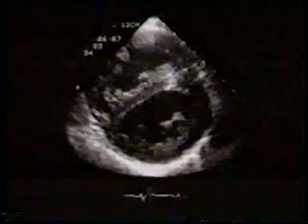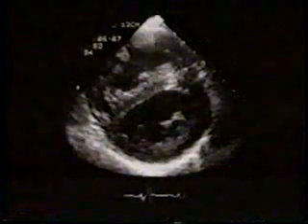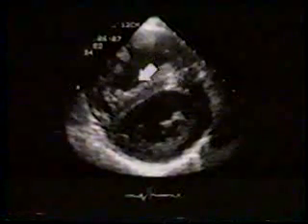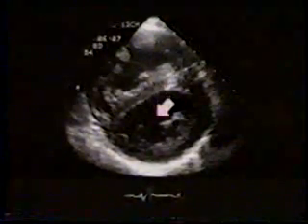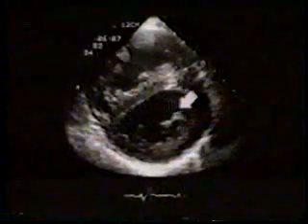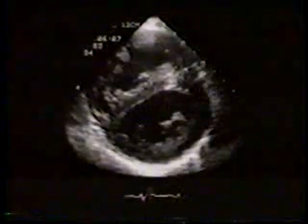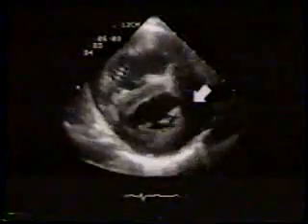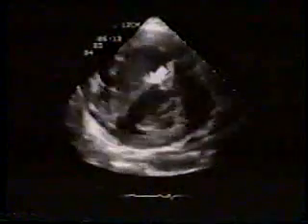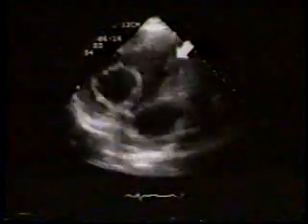This is the short axis view of the same patient. Note right ventricular hypertrophy, dilated right ventricular cavity, and normal left ventricular size. Now we will demonstrate the short axis scan in real time. Note normal left ventricular systolic function, large ventricular septal defect, and dilated overriding aorta. Here is the atretic right ventricular outflow tract and pulmonic valve.